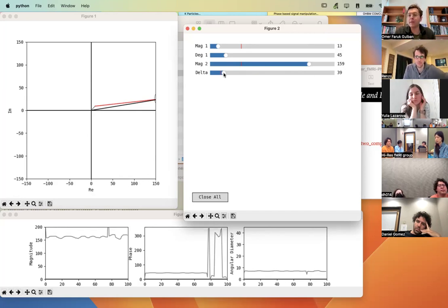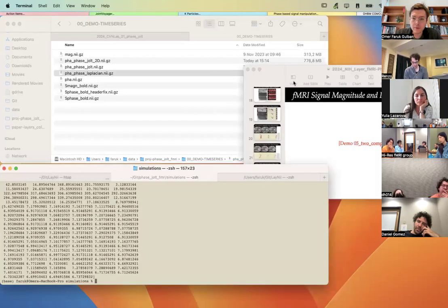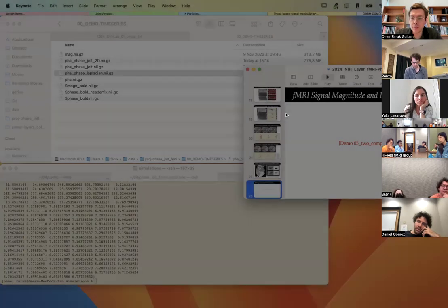But if you are in a gray matter voxel, that is partial volume in a different way, then changes due to the oxygenation as measured from the phase are not so high. That's why he pitches his method as a macrovascular cleaning or macrovascular regressing out method. So hopefully this made some sense.